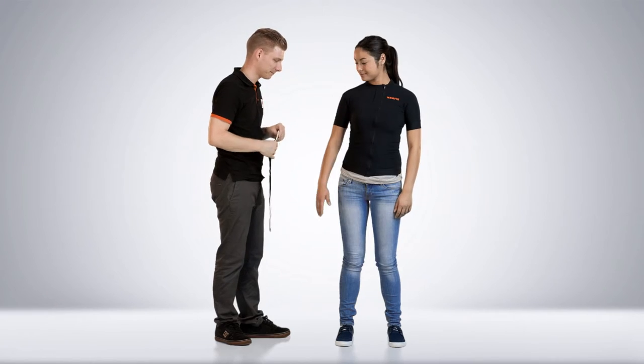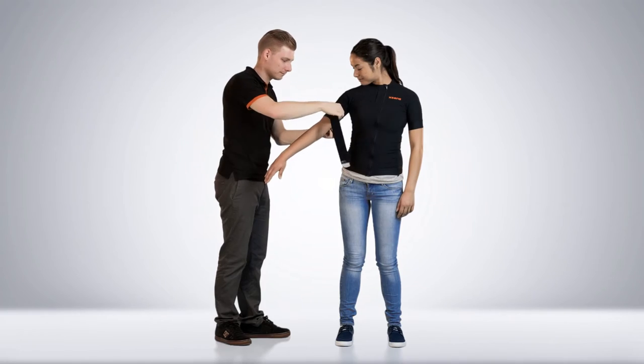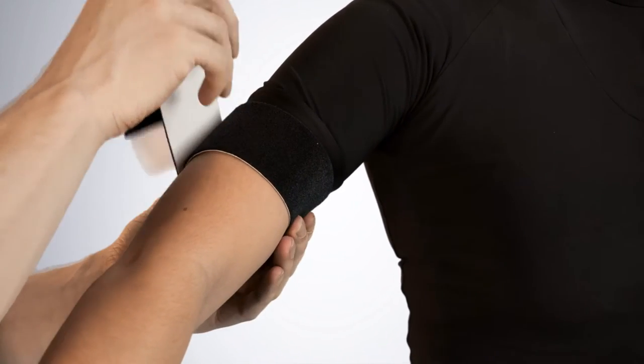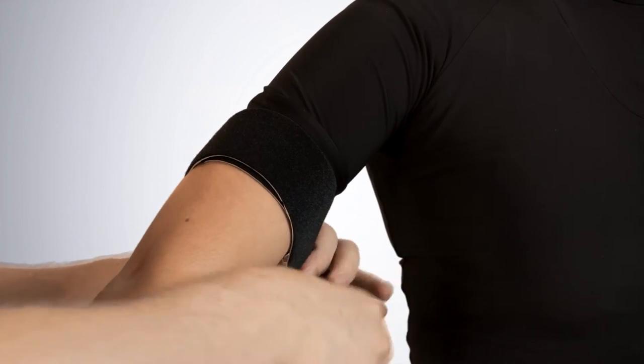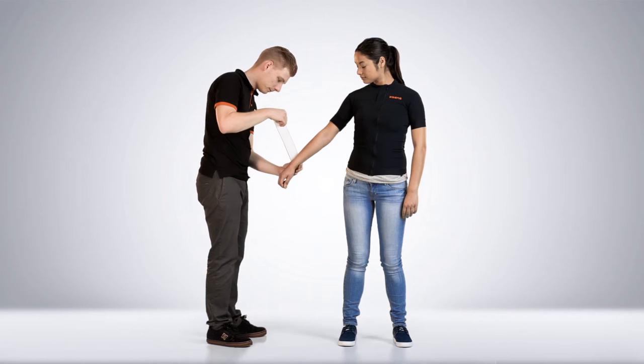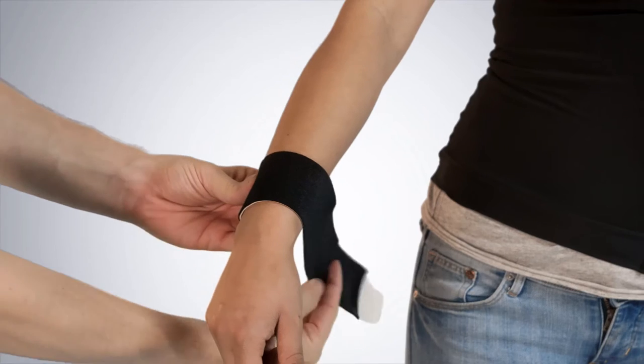Place the straps tightly to make sure that they do not shift. The upper arm strap needs to be placed in the middle. The lower arm strap needs to be placed just above the wrist.